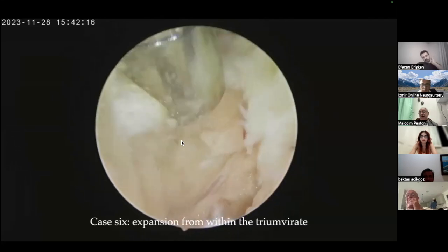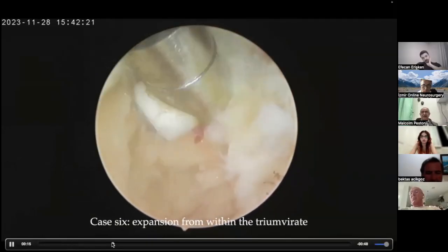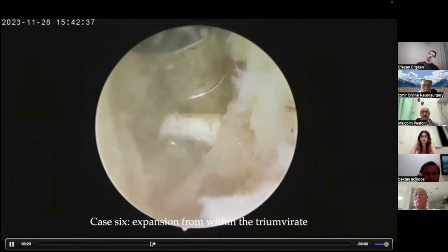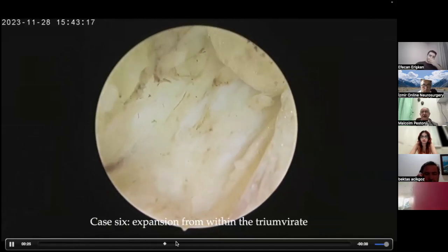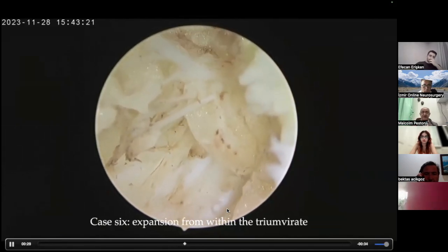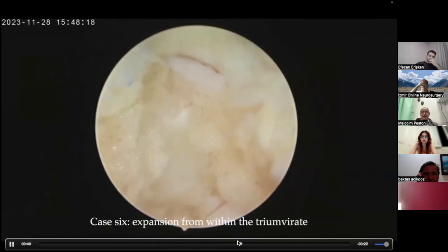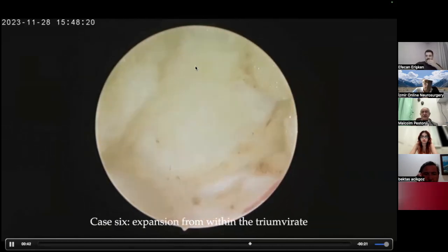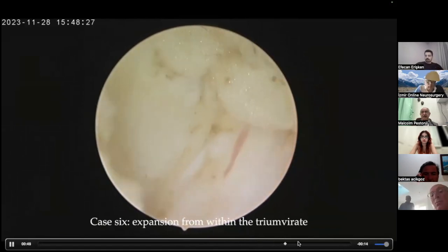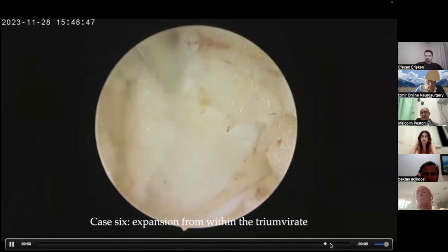Similarly, here I don't see the classical 3 veins, I see a leash of veins. So this is the anatomical variation that I came across, extreme lipomatosis. So always fire your probe towards the superior articular process, but you can see this leash of veins here. You can see the PLL below. You can see the disc surface below. You can see the root. You can see finally everything very nicely. And then finally go ahead with your discectomy and fusion surgery.